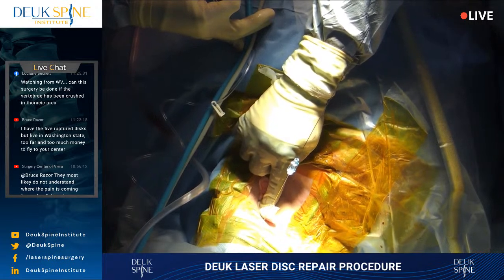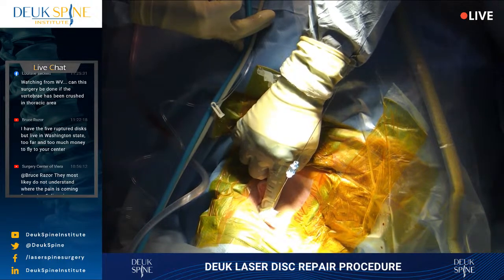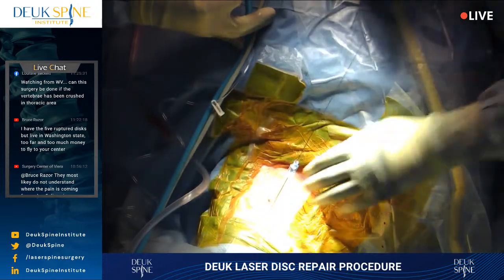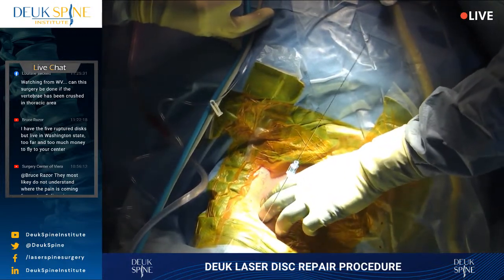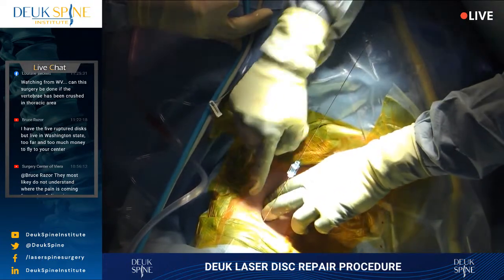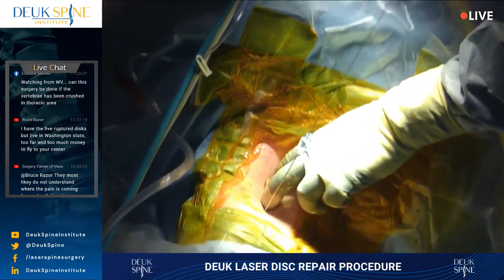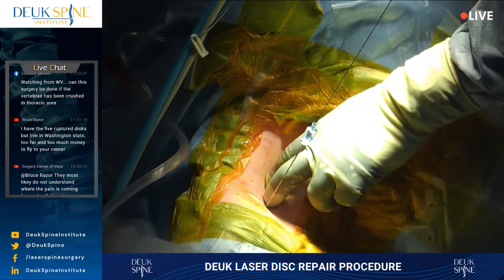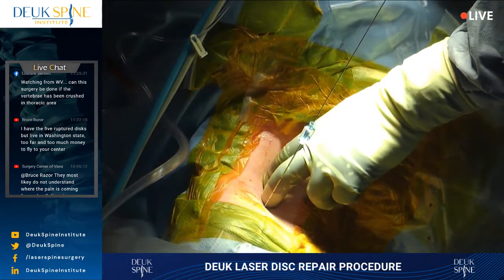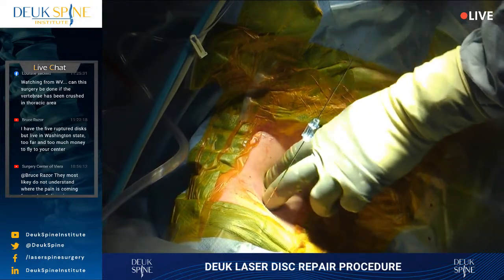And for those of you wondering, how did I get down to the spine, it's a technique that I learned overseas where you literally, and I can't take credit for this part, you put your fingers here between the sternocleidomastoid and the carotid artery on the outside, and then the trachea and esophagus medially, and you literally push the trachea and esophagus over, and you can feel the spine when the patient is asleep and relaxed. Now, if you're wanting to do these surgeries, obviously don't start doing them. You need to train, and you need to be taught how to do them like I do.